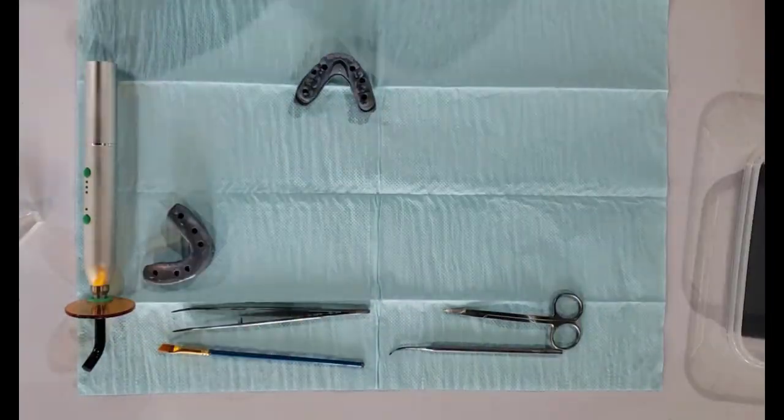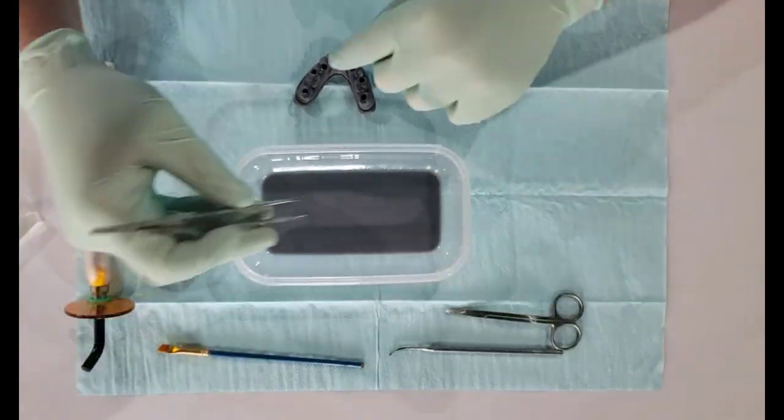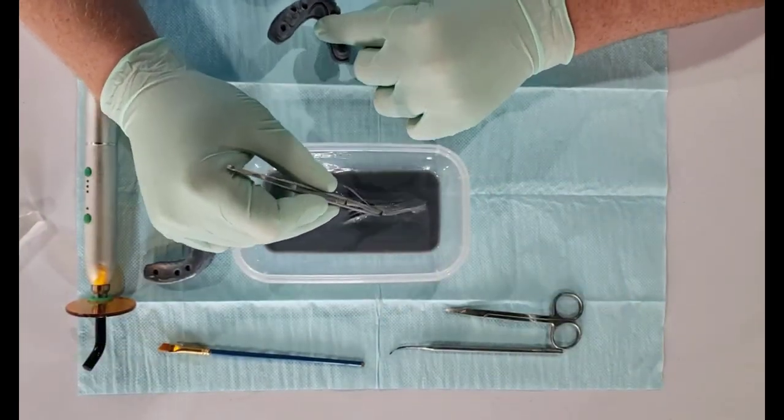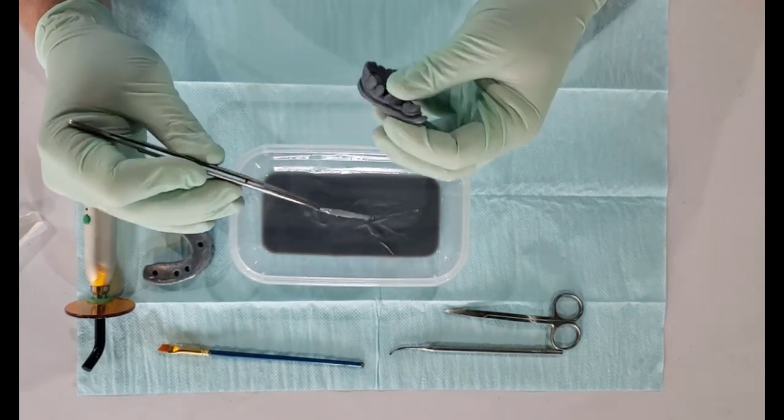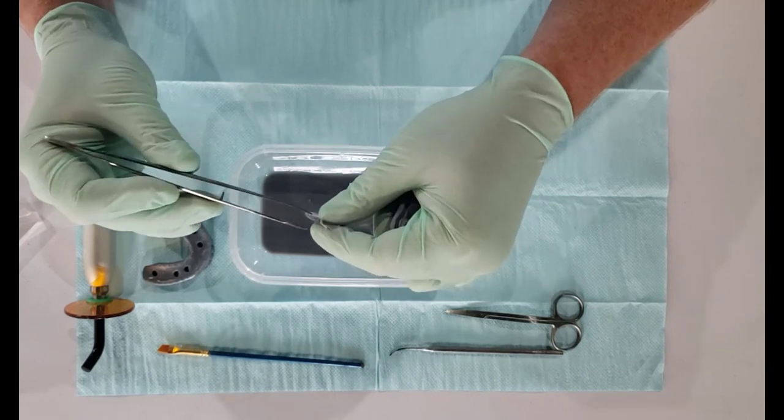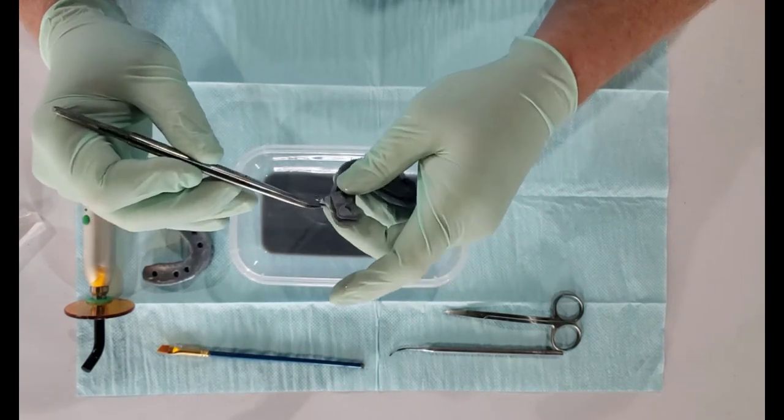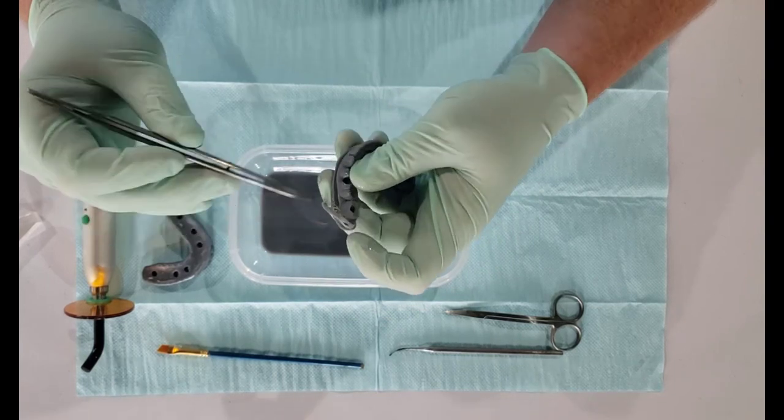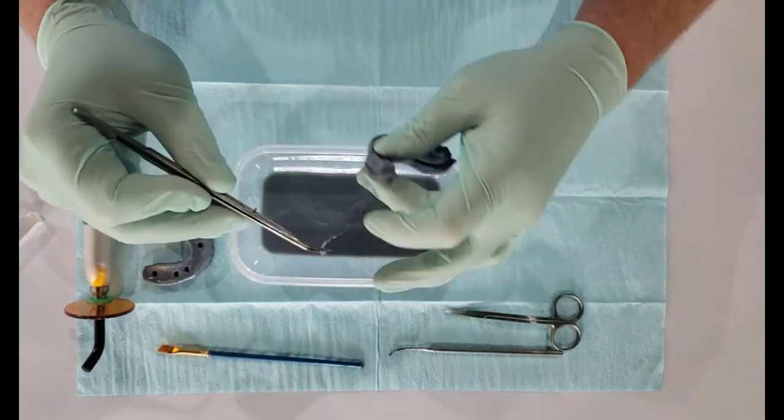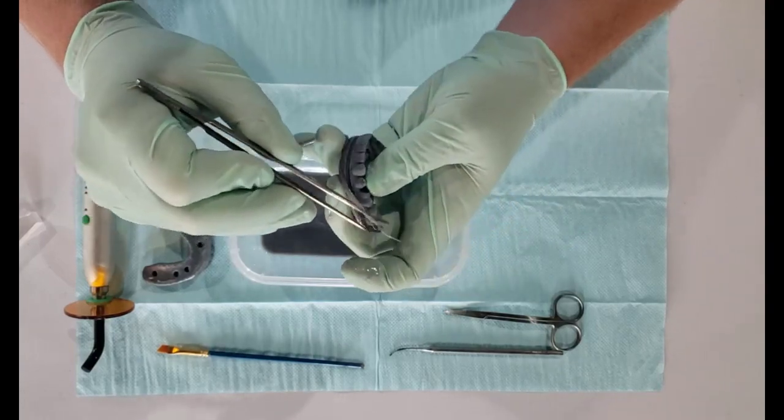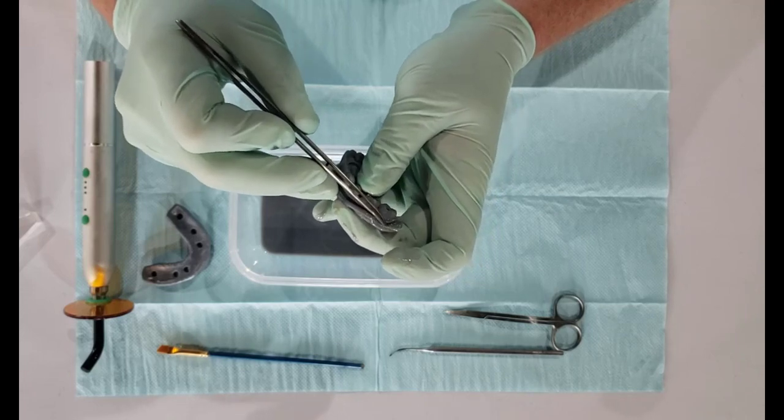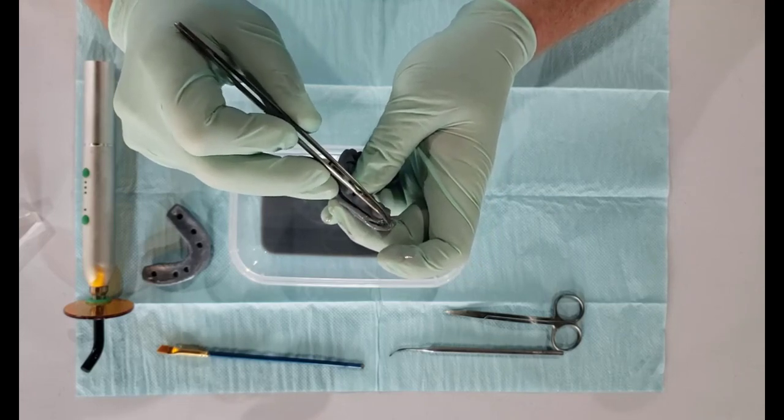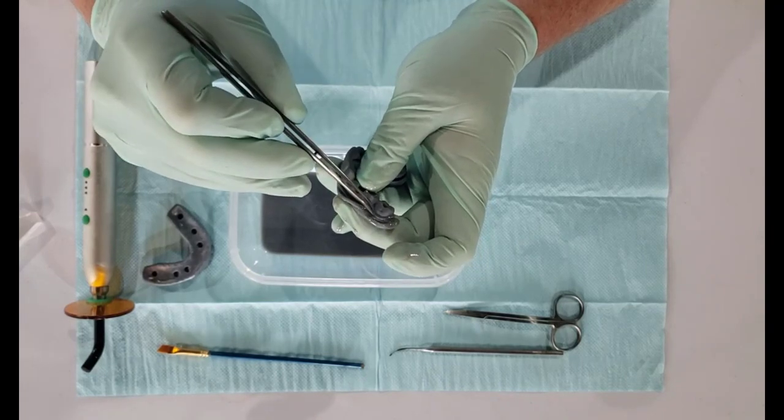Now what I'm going to do is I've taken just a bunch of fiberglass strands. Obviously you want to use some dental strands, but the stuff I'm using right here I just got from Walmart for working on auto body. For my purposes, that's all I need because the principle is the same. With anything dental, you get to write the word dental on it and charge a whole lot more for it. I'm just tapping in these little particles.